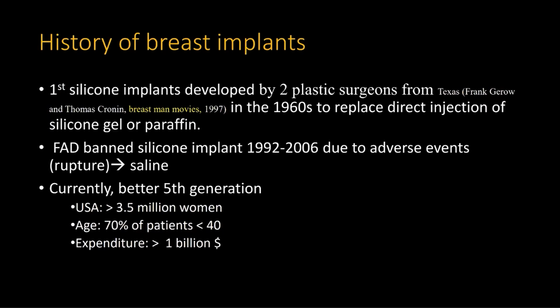However, there were lots of ruptures and other adverse events associated with the silicone implant. That's why the FDA banned silicone implants in 1992. The FDA didn't lift the restriction until 14 years later, after a better material for the implant shells was developed. So now we are using the fifth generation of the silicone implant.